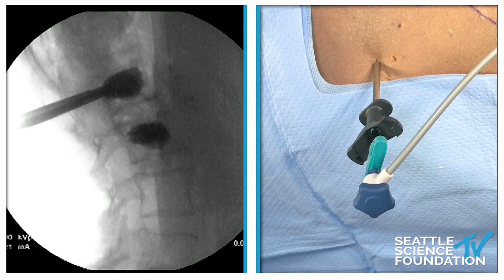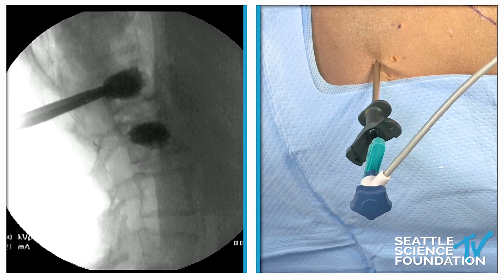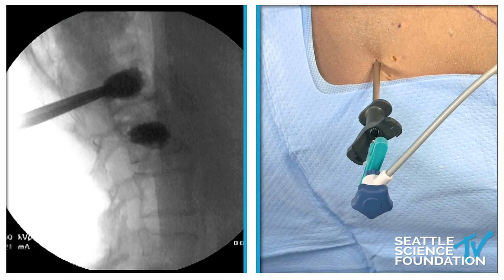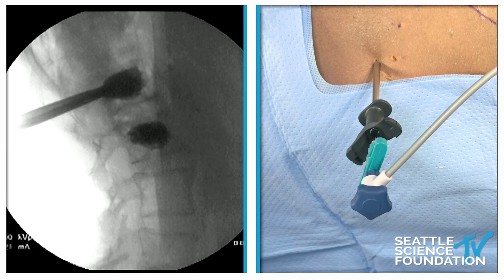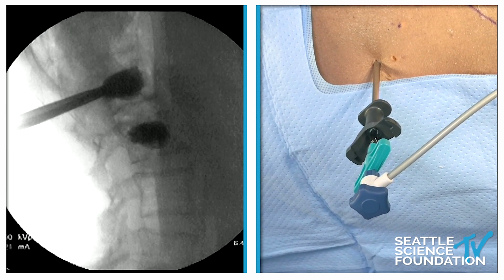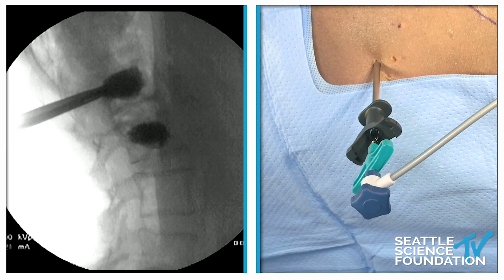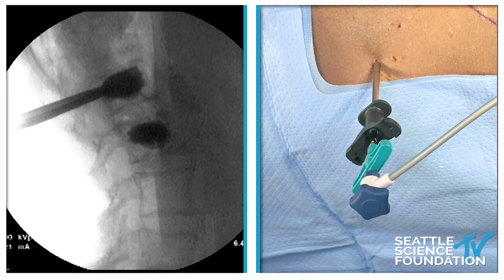15 to 20% of the non-compressed level. If there's a single mistake that a lot of people make, it is not injecting enough cement. So that's the single biggest error that I see. You want to be able to treat the incident level fracture, you want to be able to fill it, and you want to make sure that you have enough permanent stabilization in that vertebral body to stabilize it over time.